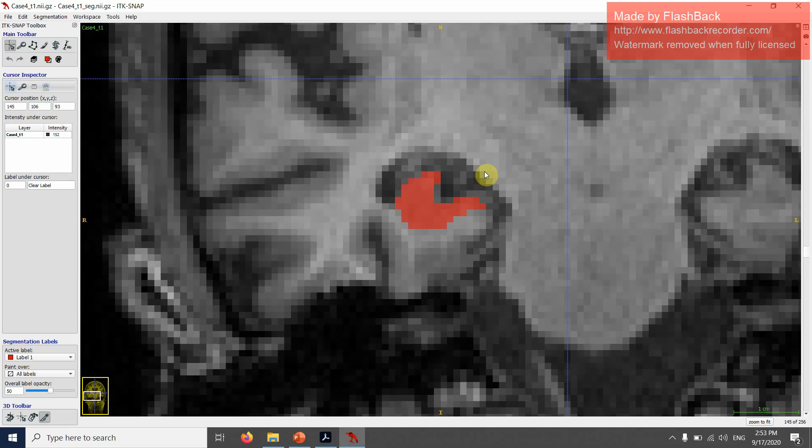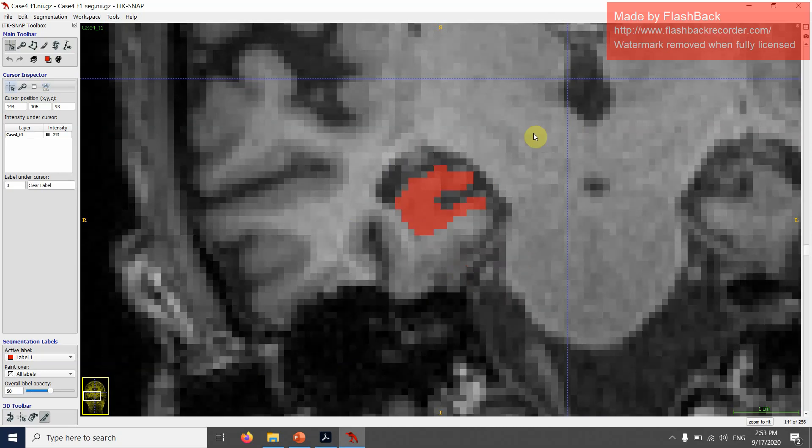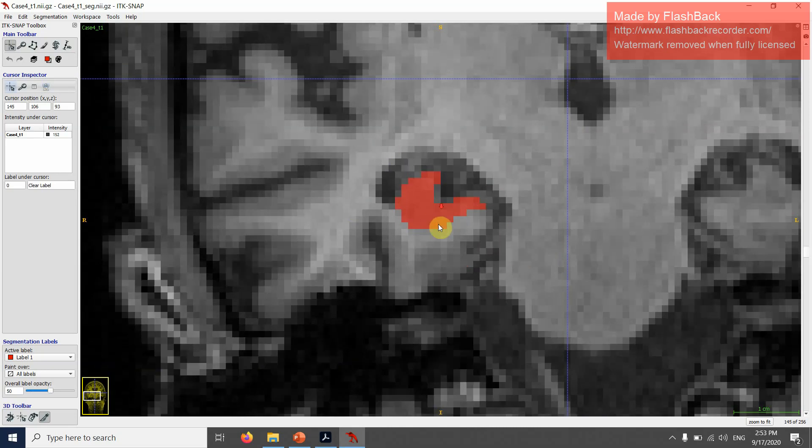I think the important thing is when you're segmenting your own data set, to make this decision the same for each subject. Be very consistent between subjects. I think this is an ambiguous one. This unfortunately happens. I'm now deciding that this is the last slice with the uncus, and this is the first slice of the posterior hippocampus.